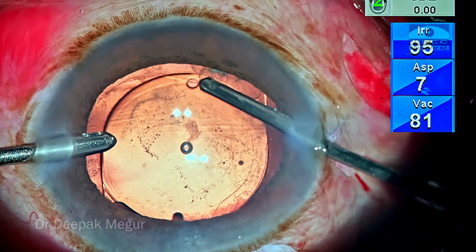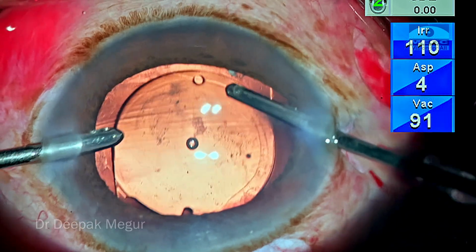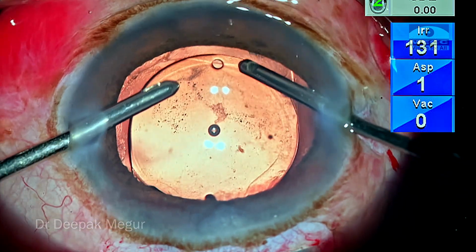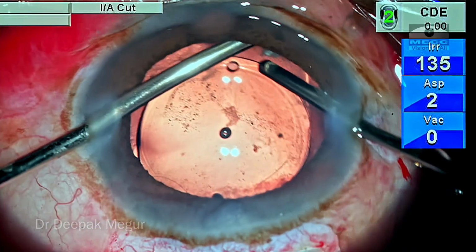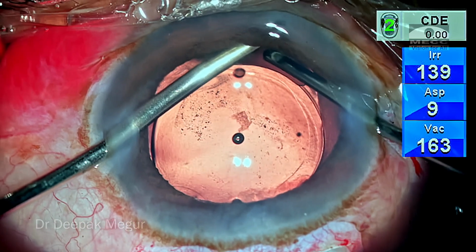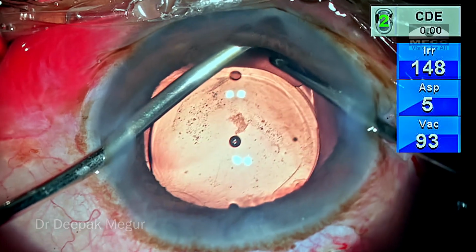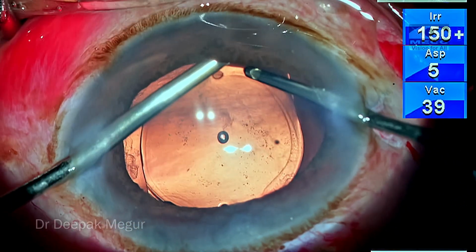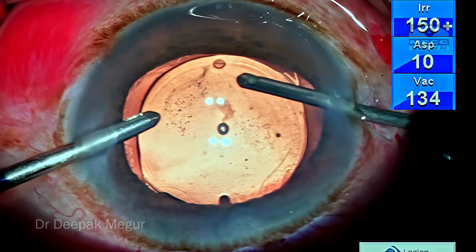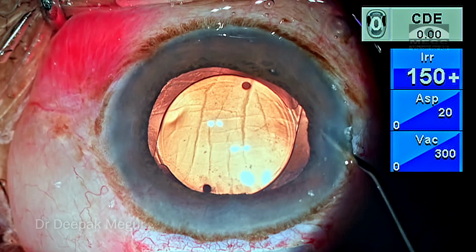So it just takes a couple of minutes to do the anterior vitrectomy. The prolapsed vitreous is taken care of. I retract the iris with my irrigation cannula and try to go in as peripherally as possible just to engage the vitreous and then cut it. And then I'm going to inject a little bit of pilocarpine to get the pupil down.